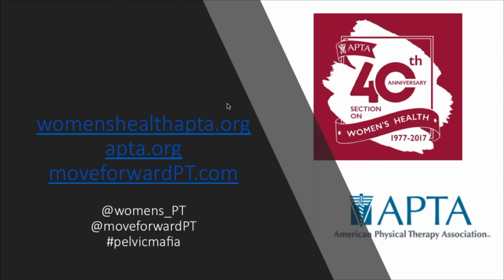With respect to utilizing it for erectile dysfunction, I think it depends on what the hypothesis is as to why there is erectile dysfunction. So if it's a potential muscular or neurological issue that would require assessment of the pelvic floor, then sure, I think ultrasound would be beneficial for that. If there's some other reason that's different, wouldn't necessarily require that, then no, I wouldn't use it.